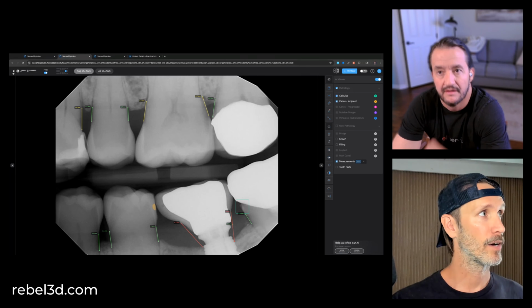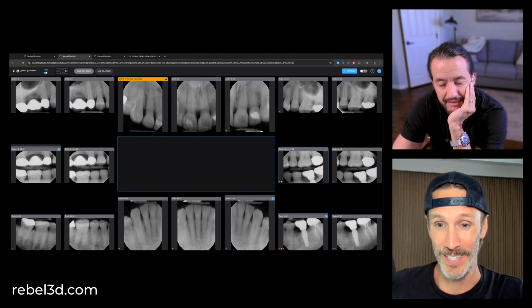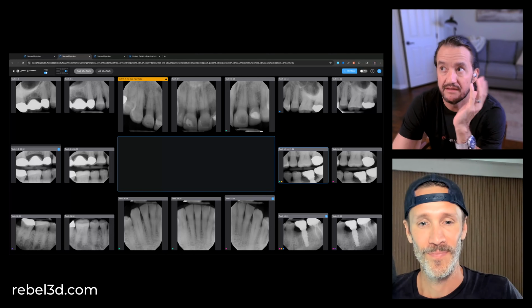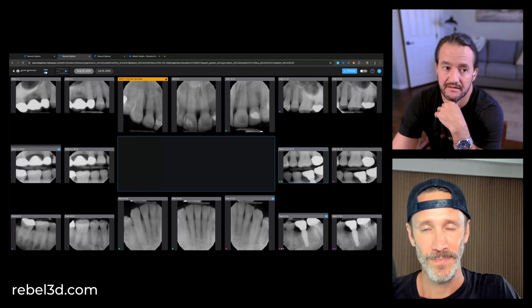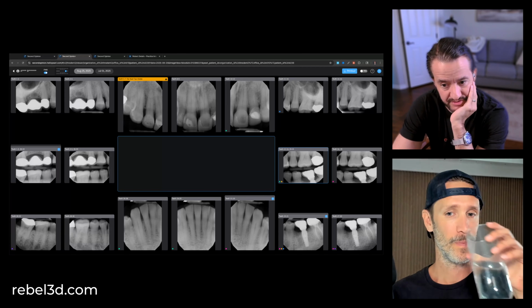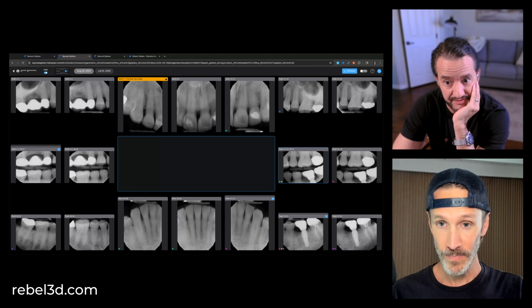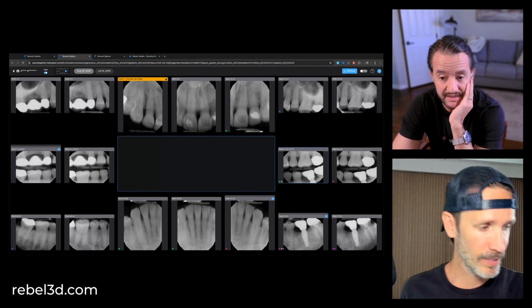So they're getting better insurance reimbursement too. Yeah, talk about that for a second, the items being rejected from insurance. Do you get doctors saying, hey, I have better reimbursement rates now that I've got this AI tool? Sort of backing that up for me?